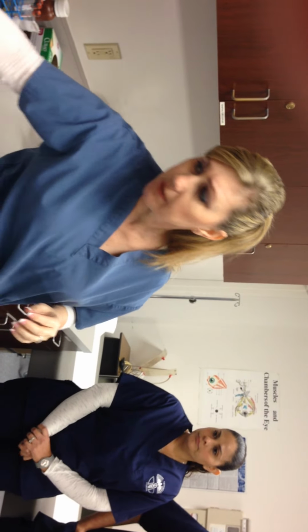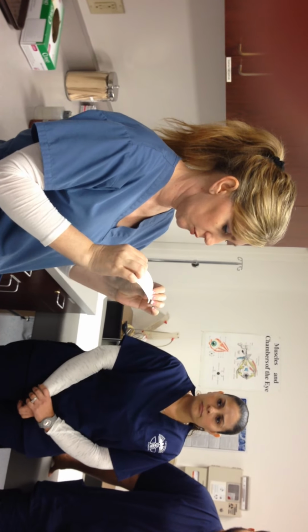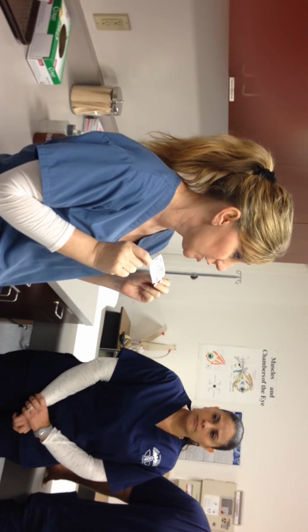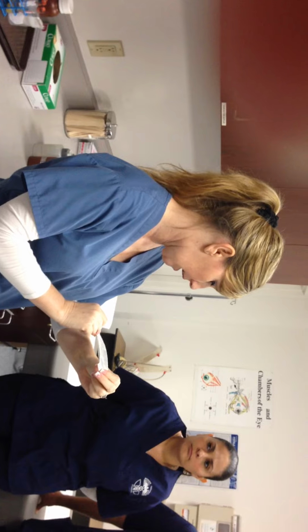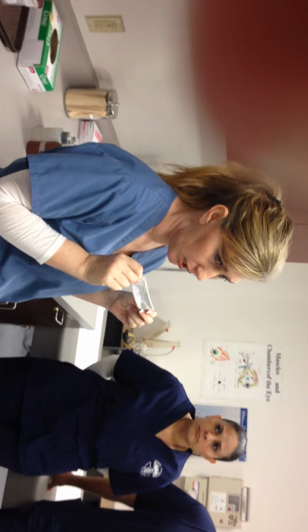Now, we talked about this already, your needles and your syringes, right? So 27 gauge again is how thick is your needle, the diameter of your needle. And then this one's by, what's this one? Half inch. So this one's super tiny, okay?